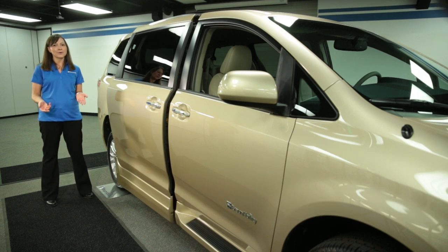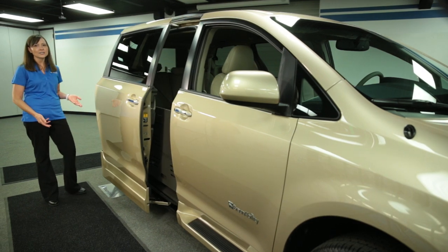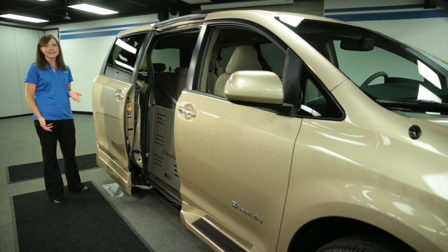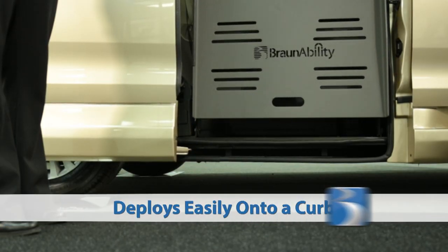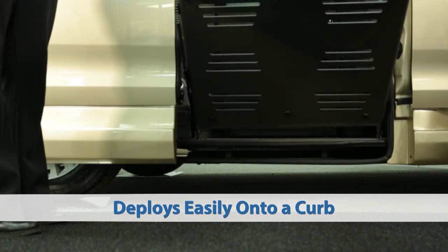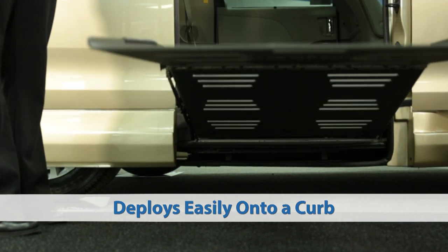It's simple, easy to use, easy to maintain, and time-tested. Here are a few things that make the BraunAbility fold-out ramp unique.